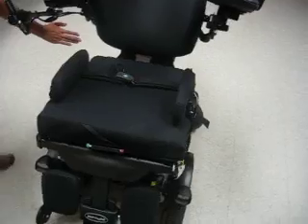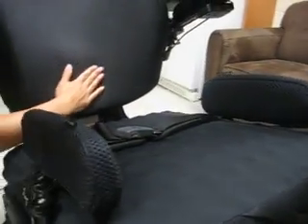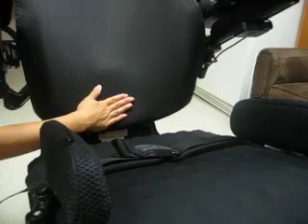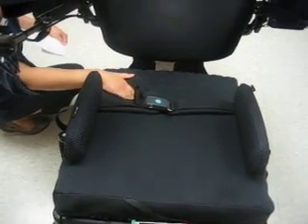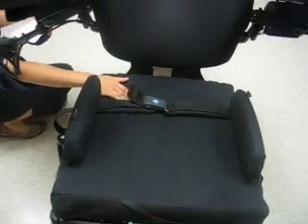And lastly, you check the back. Slip your hand in, check the back to make sure the patient is right at the back of the chair and making contact with the backrest. And a final check of the cushion is advised by slipping your hand under the ITs to check the height of the air in the Roho cushion.